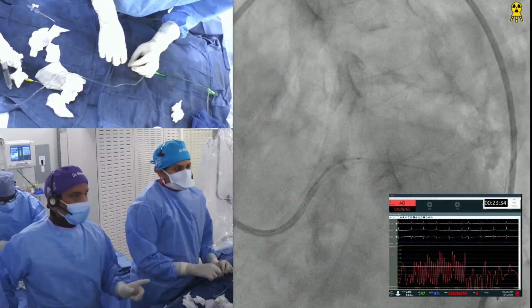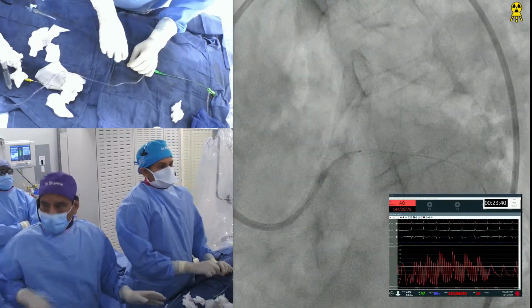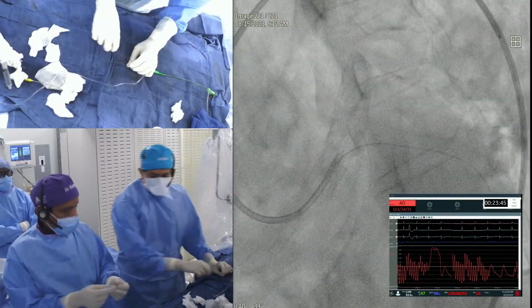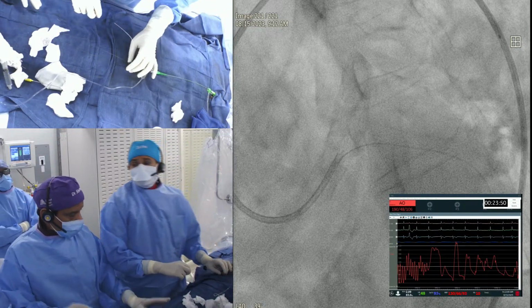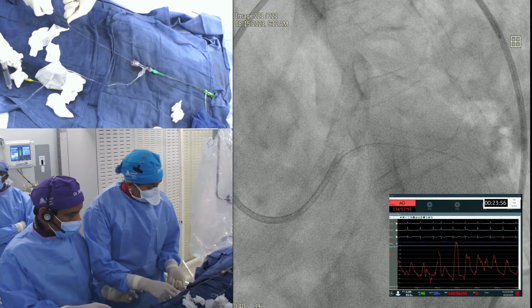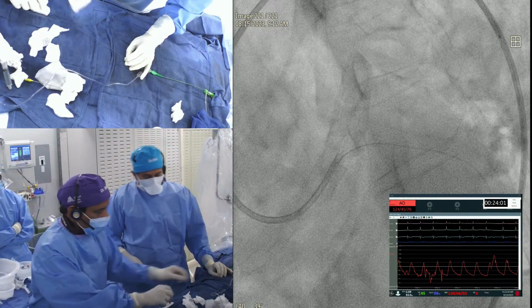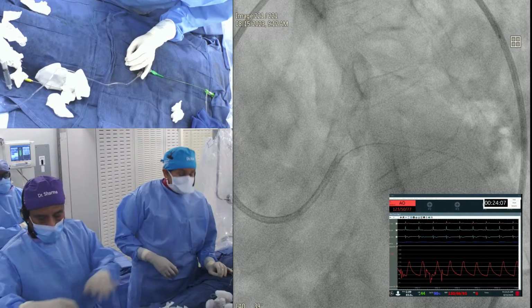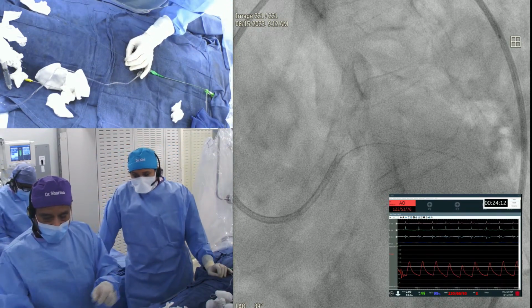Now here, if you want, you can do a cutting balloon. Try the Synergy. Or you want to get a cutting balloon, 3.5? Synergy won't do anything. Okay. Don't even try. No, try Synergy. Yeah, good. But let's say cutting balloon. It's wasting. No, but that's okay. Yeah, Synergy. Okay, good. Keep it there. Synergy will try on our run-through wire. So this is actually a test. We'll return this to Boston Scientific if one goes versus the other does not.